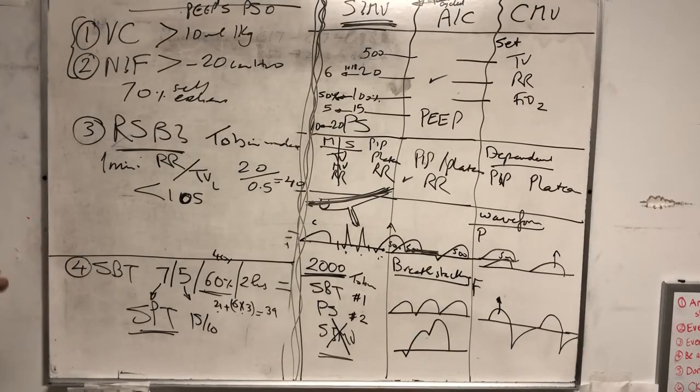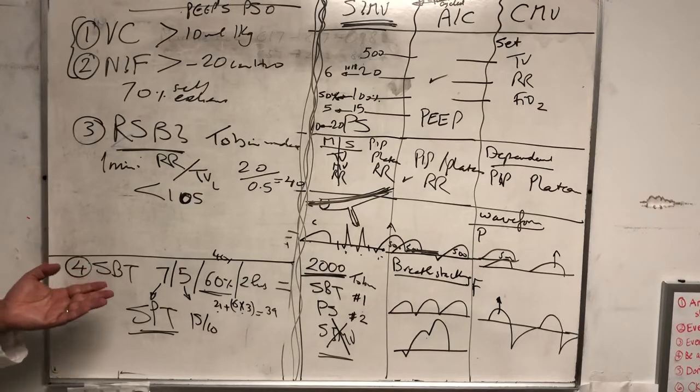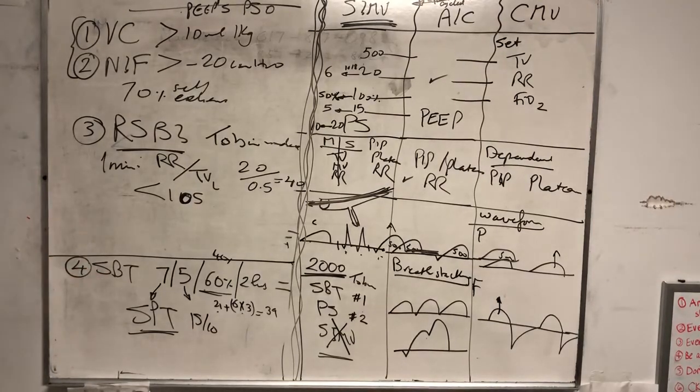And you can't have a successful SBT and say, I don't feel like extubating the patient. No, that's the whole point. That's the whole point that made SBT famous, that it makes the intensivist prediction worth nothing, right? Patient passes SBT, you extubate the patient, right? Unless there's a difficult airway or other extenuating circumstances.